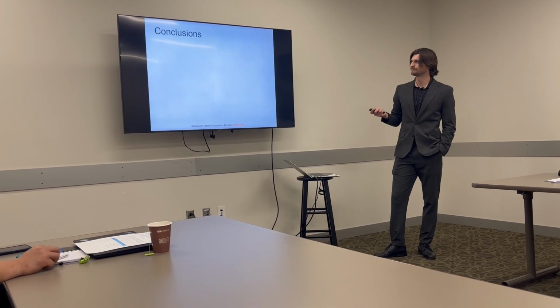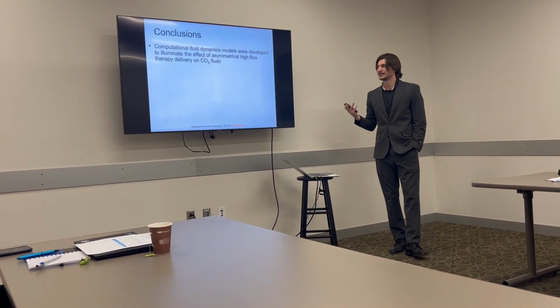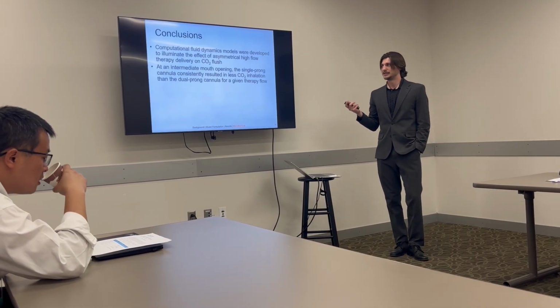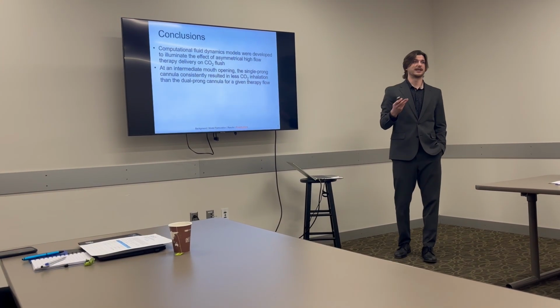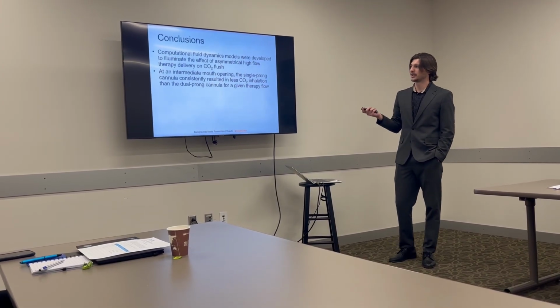In conclusion, we developed CFD models to investigate the effect of asymmetrical flow on CO2 flush for high flow therapy delivery. At an intermediate mouth opening, the single prong cannula consistently resulted in lower CO2 inhalation than the dual prong cannula.